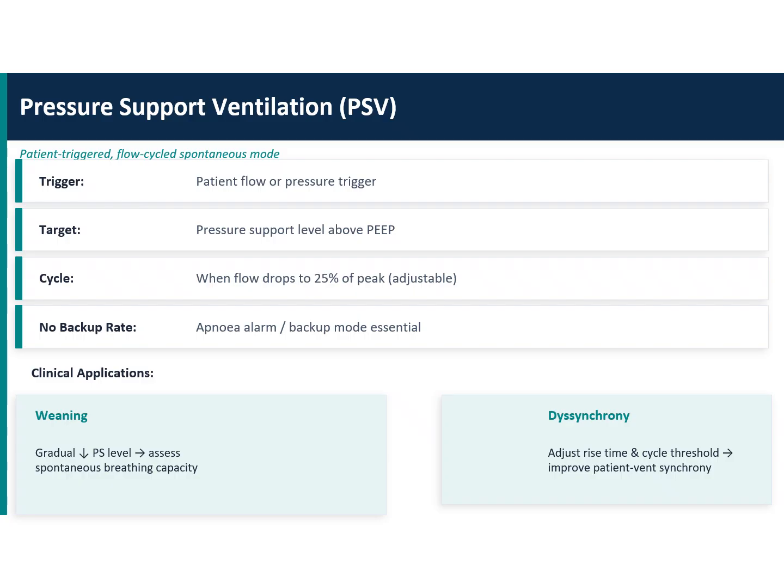And once you put the patient on pressure support ventilation, you look at the tidal volumes they are generating, and how comfortable they are. If the patient is comfortable breathing and generating a tidal volume of at least 6 ml per kg with whatever pressure support you are giving, then you have to come down on pressure support slowly, and once you reach a pressure support of 5, that is the time you can take the patient off the ventilator.